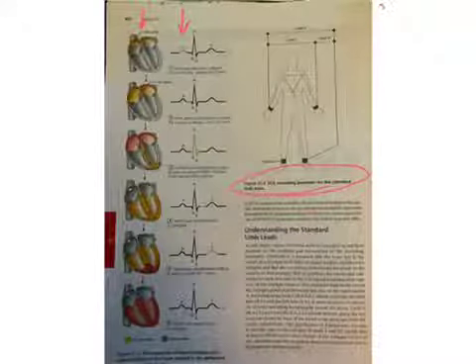I was really sick a few years ago and I woke up with horrible, horrible chest pain. Went to the emergency room, said I had massive chest pain. That woke me up. And before they even knew my name, they had me in a room and were collecting an electrocardiogram. How they did that is they ran what's called 12 leads, where they put electrodes at various parts of my body to monitor different aspects of the heart.